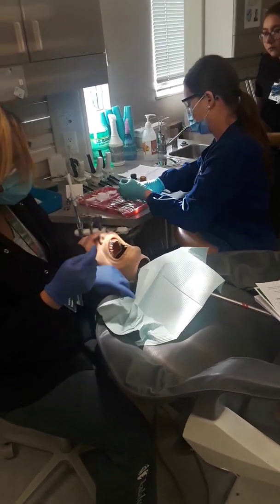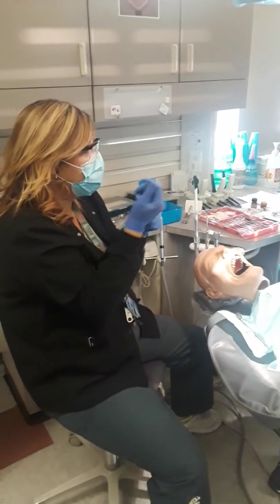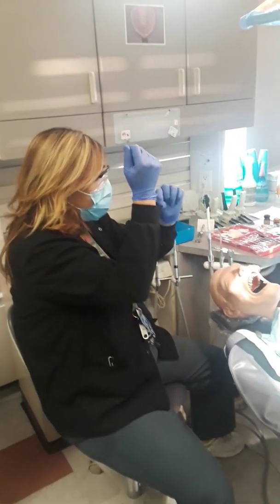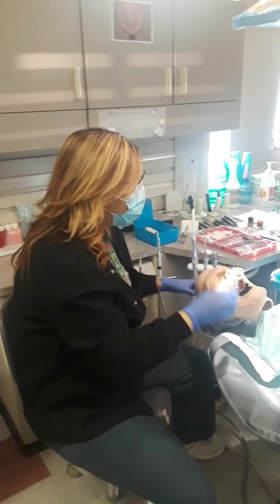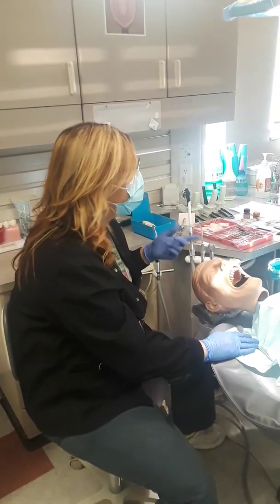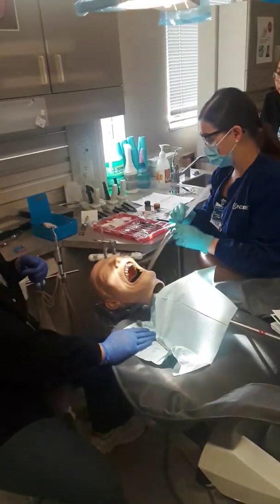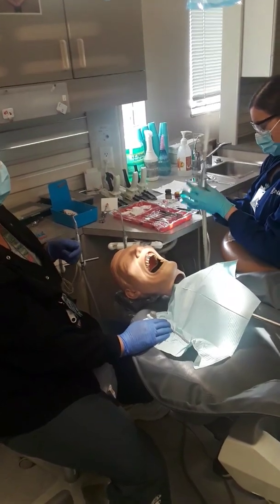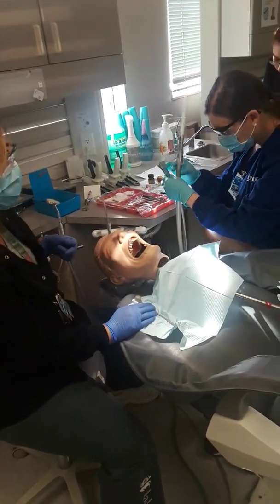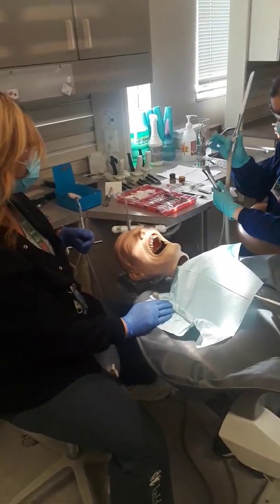When we pack this into the sulcus, you're going to create bleeding because you're probably pulling the sulcus like this, okay? So you want to rinse and dry, completely dry, because any moisture or blood is going to ruin our final impression, and that's what's next. So I don't know if that's listed. Please add that if it's not, because that is a requirement for me if I check you off.